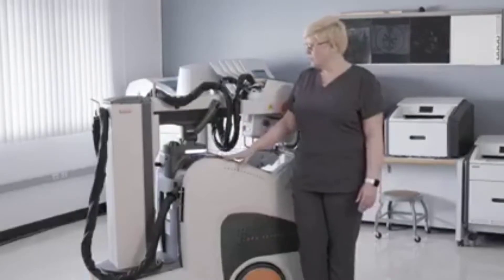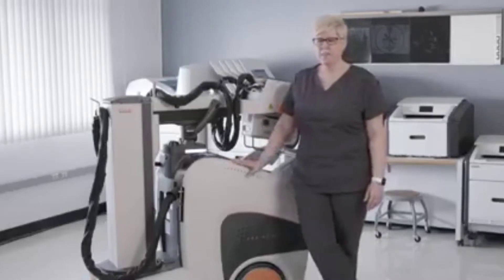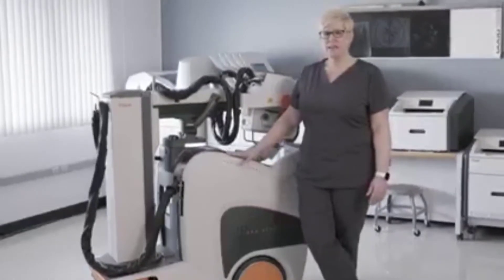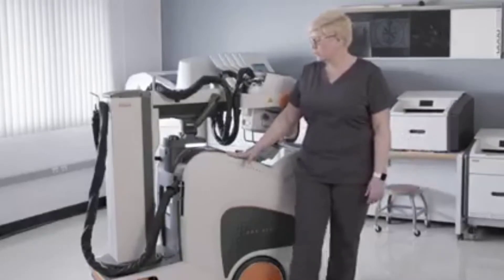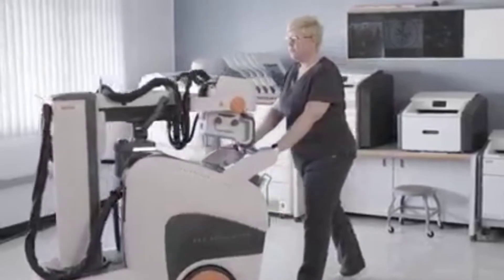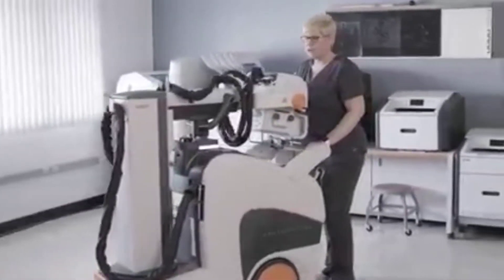CareStream engineers have redesigned that system today with the HUSH initiative in mind. There have been scientific studies proving that patients heal much quicker when they receive more rest and receive less interruptions by hospital workers. So with the redesign of the cart, the engineers have dampened the motors, making the sound of this cart driving in and out of patient rooms pretty much inaudible.